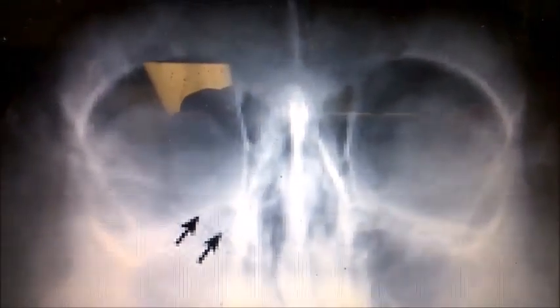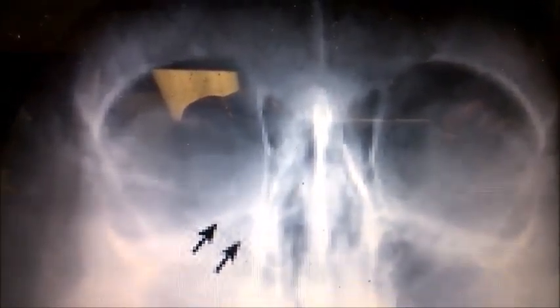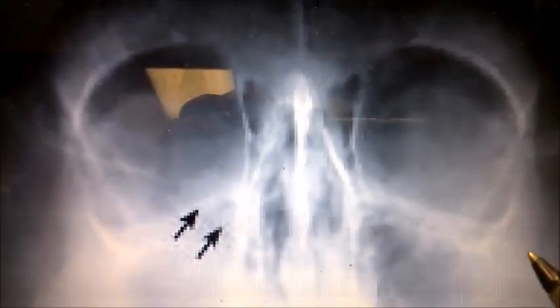Here we have a PA projection of the orbits during a Waters method, and what we have here is the petrous ridges lying way below, far below the maxillary sinus, so there's no superposition of them whatsoever, and there is no rotation.